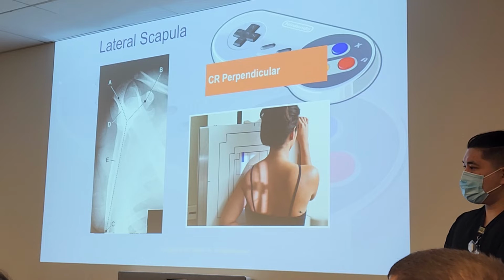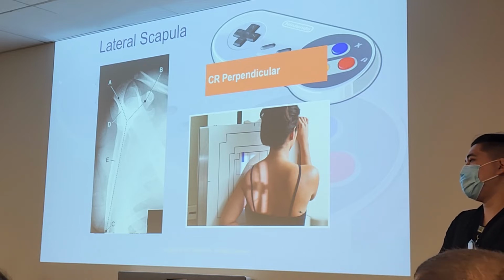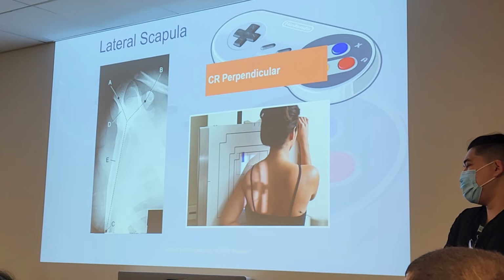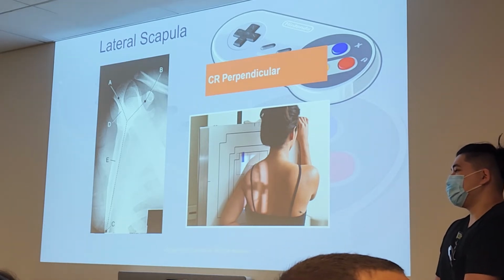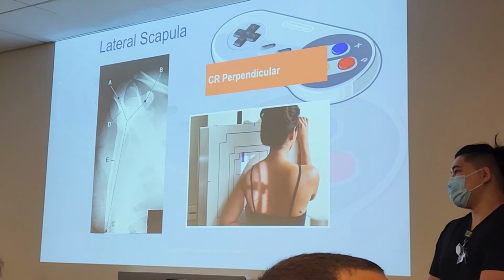The cassette has Wi-Fi. She told me that she was trying to. Probably the sky plate, the digital plate, right? I am not sure on that, I'd have to see the technology. I've never heard of a cassette having Wi-Fi. They have Bluetooth to connect to the computer, to scan and identify. Or maybe the battery?